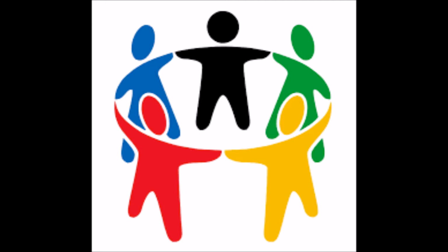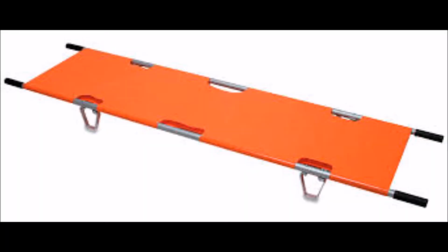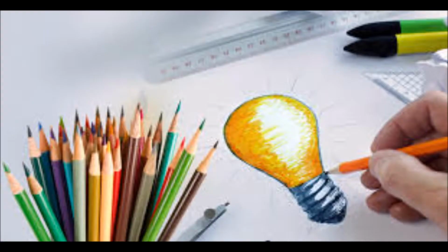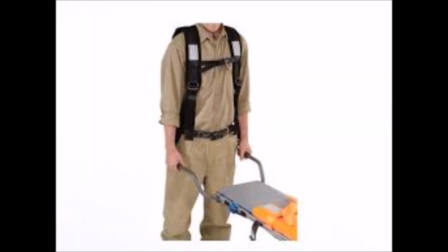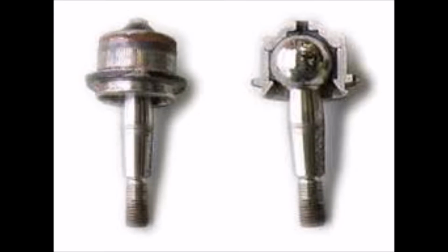Requirement capture. In order to solve this, we created a stretcher that will be able to maintain a stable position despite all the movement that may occur. The basis of the design is to have the stretcher suspended with multiple joints located along the handles for the medic to carry. When the casualty is being transported, the joints and ball bearings that will be used for most of the joints will reduce the amount of movement that the medic has unintentionally created.